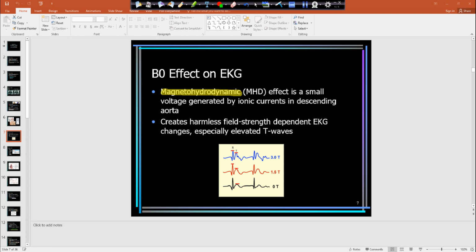Which particular letter are we usually starting our excitation pulse from? Which one? R. The R wave, because the R wave has that spike. That's when the ventricles are contracting, and it creates this major spike.